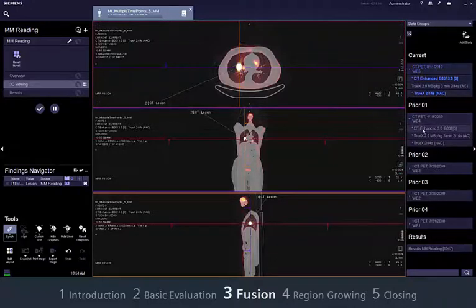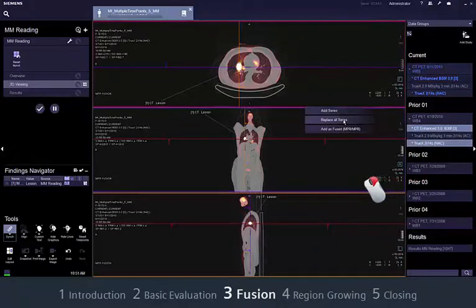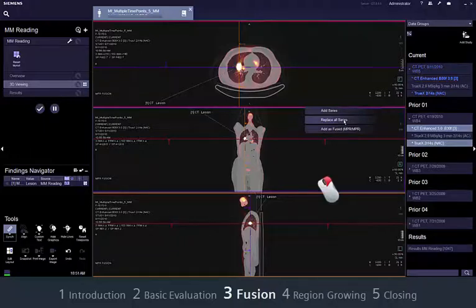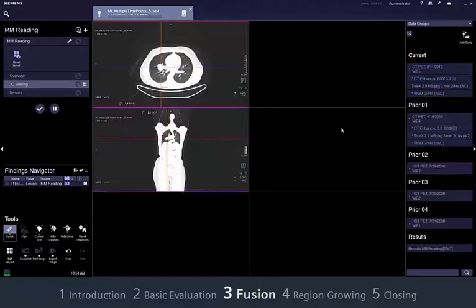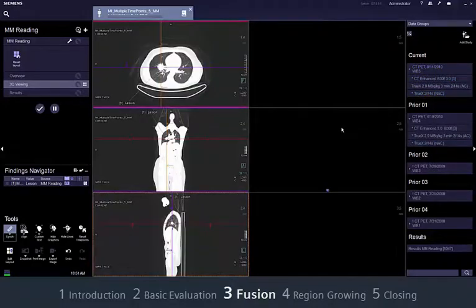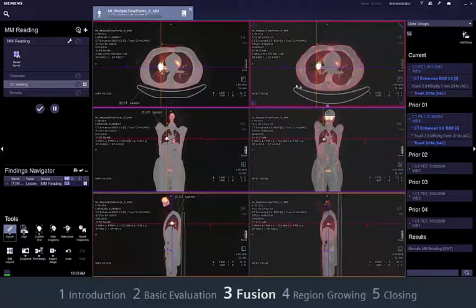If no data is yet displayed in the image area, go to the series navigator and select a CT series and the corresponding PET series from the same time point. Right-click and drag the two series into a segment, then select Add as Fused MPR/MPR from the context menu. In both cases, the layout changes to a fused display.